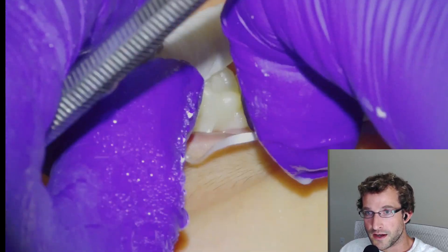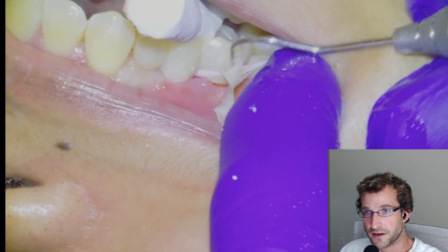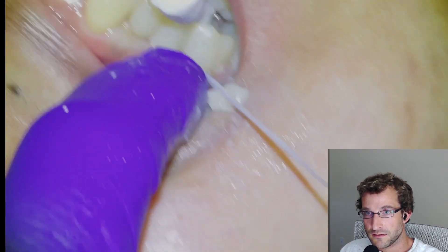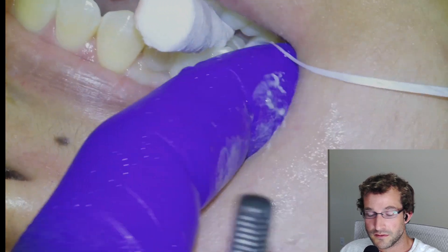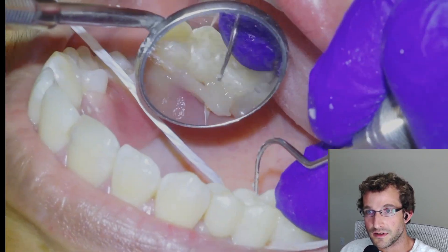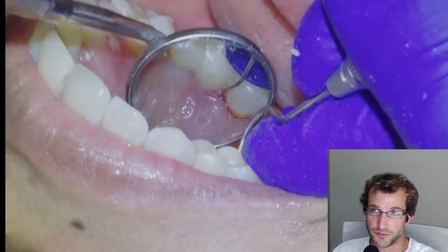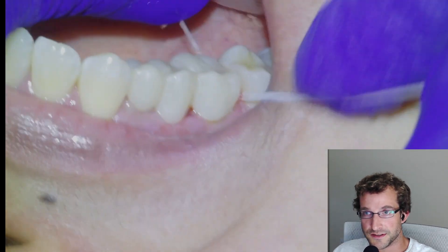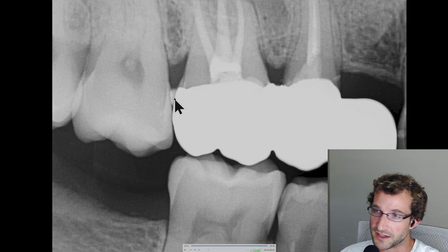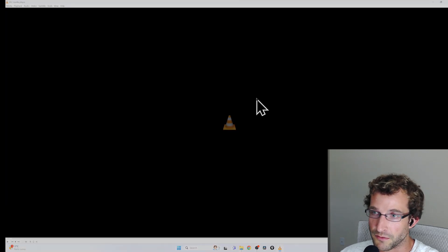Bite down and put some really heavy pressure — bite down as hard as you can for about a minute. We tack-cured and then removed the excess cement from the buccal and did the same for the lingual. Cure the lingual, remove the excess, and then use some floss to push around and dislodge any more cement. We took an x-ray to check for any remaining cement — which we did find — so there was a little piece of cement that we went back in and fished out. This is the final result and we've followed up — it's working well. Patient's happy.